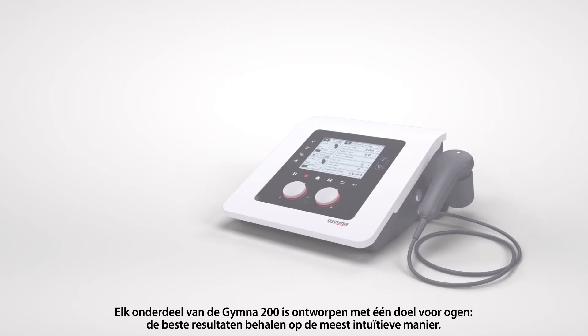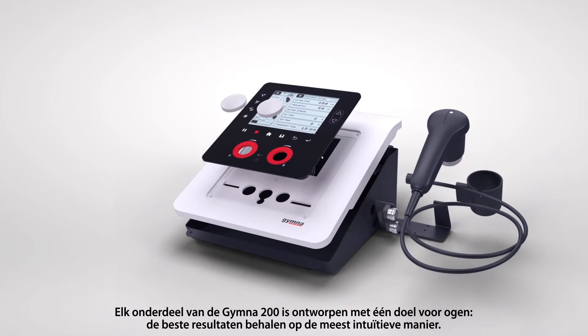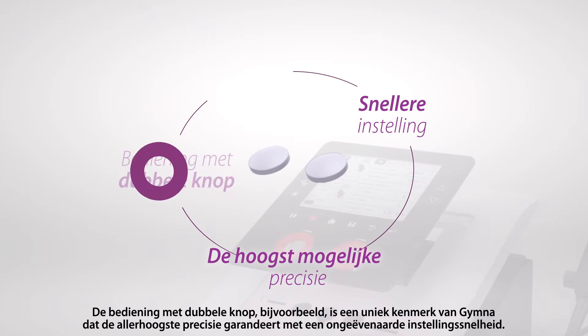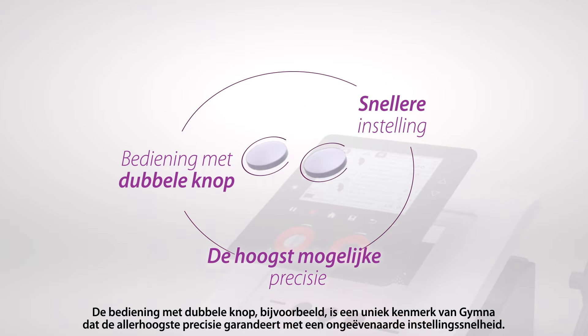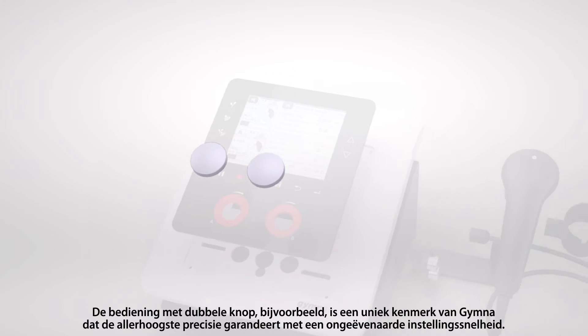Every part of the GYMNA 200 was designed with one thing in mind: getting the best results in the most intuitive way possible. The dual-button control, for example, is a unique feature of GYMNA that guarantees precision at its best with unmatched setup speed.